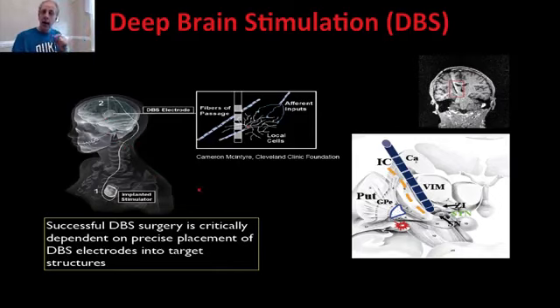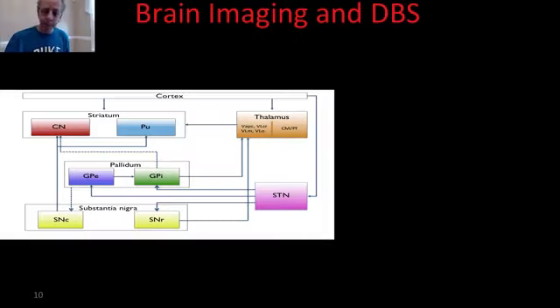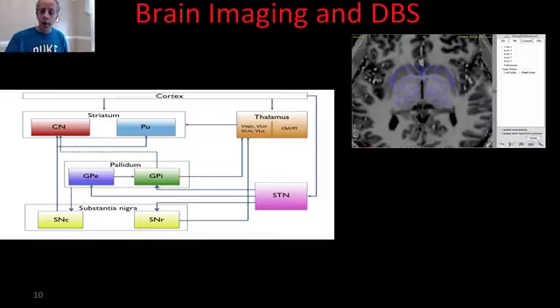Now, the big challenge here is to find the target, to find where you want to put that electrode. That is normally done with the help of a number of components, two of them being a model. Basically, brain neurosurgeons know about the brain, they know the literature, and they have a model of the different regions in the brain, and some are expressed here in a schematic way.